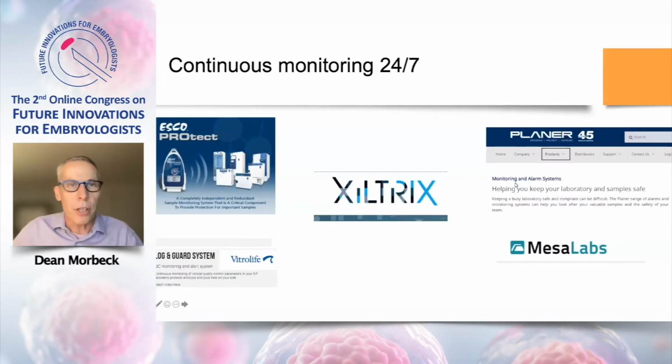But there are even further innovations, such as here, showing different companies that do 24/7 continuous monitoring, such as Ziltrix and the others shown, which obviously give you much more data than just a single time point that's done manually. So this is all going to feed into an automated system that allows us to track all of these things.